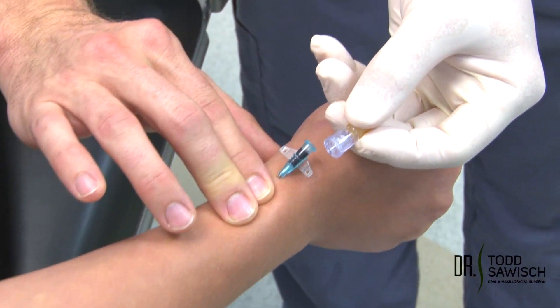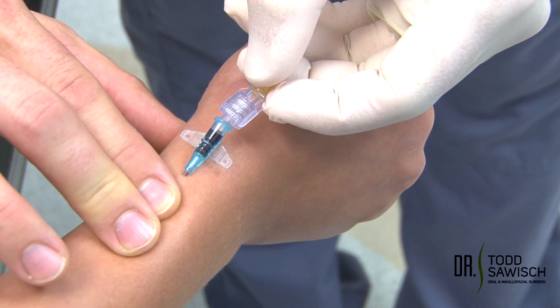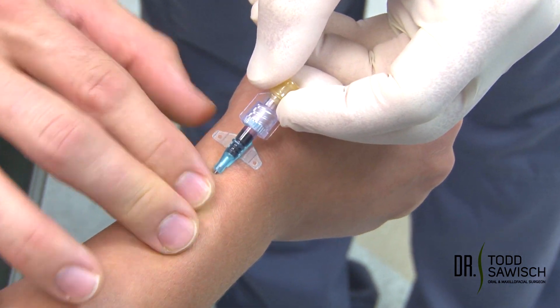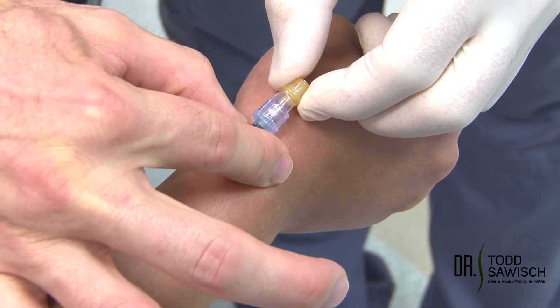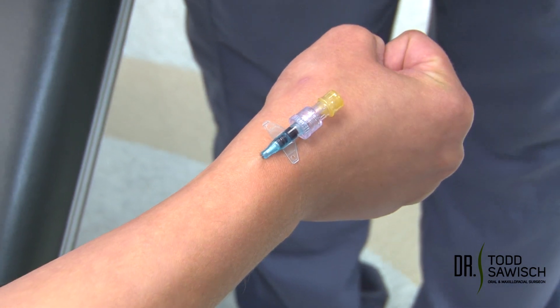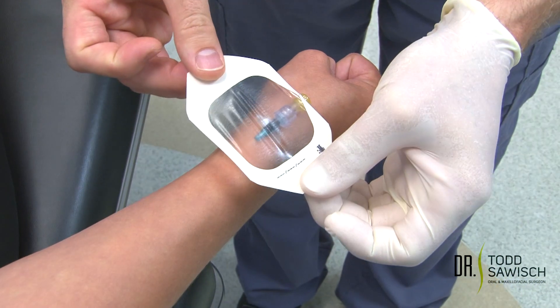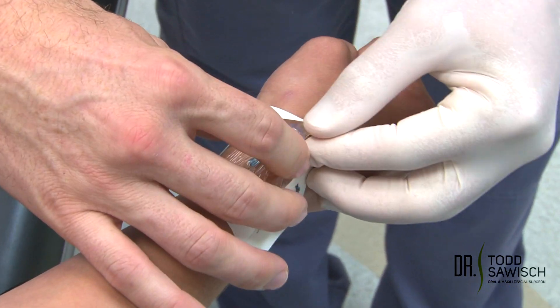This is what we call an adapter button for injection. We're going to secure this on, rotate, hold the wings so I don't get blood on me, and tighten this. Now we're going to put on what we call a tegaderm — this is an occlusive barrier that we put over this to keep it secure.